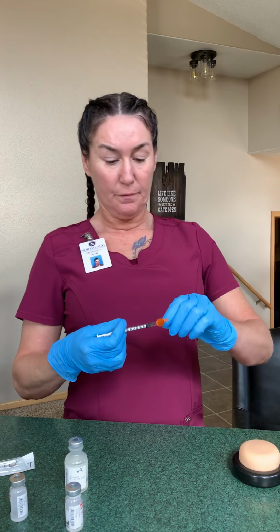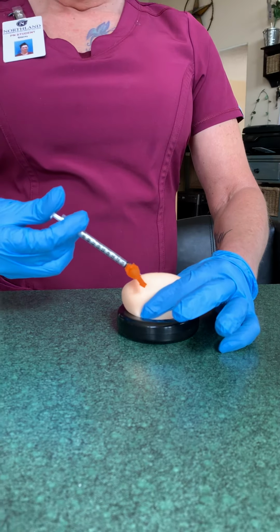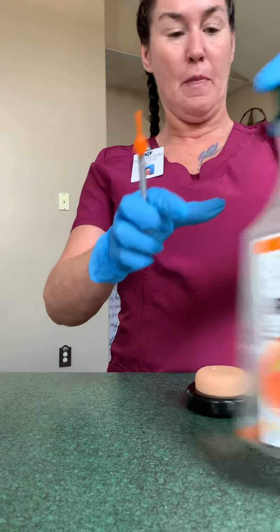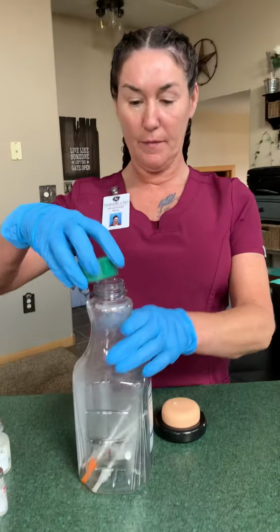And for the injection, you're going to uncap. You're going to want to squeeze. And there you have it. We'd always put the safety cap back on ours. And again, make sure it goes into a safety sharp container.